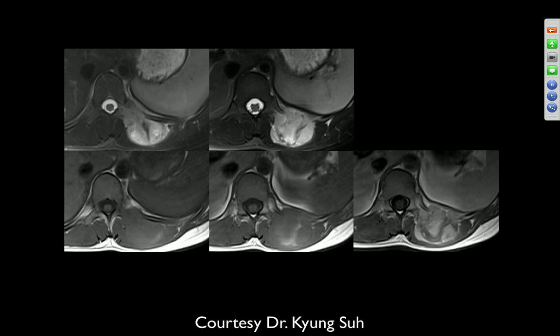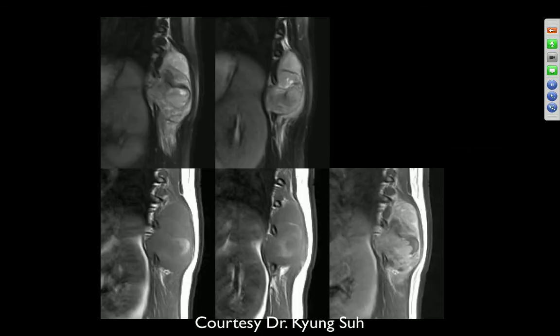So I think about a met or... I won't be showing very many mets. Yeah. Granulocytic sarcoma. Or AML history. Okay.